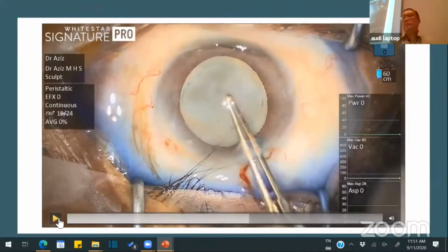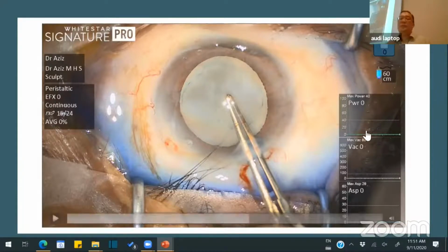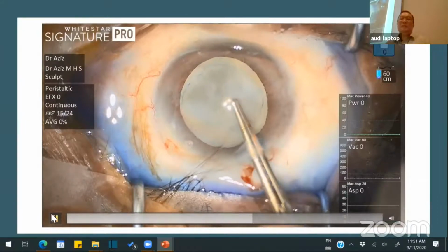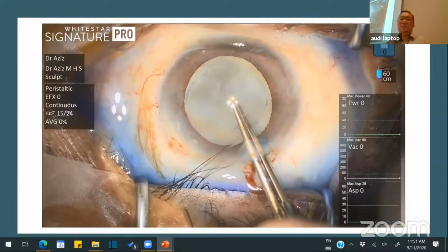So with this intumescent cataract, mostly people would just insert a needle in, aspirate. How much can you aspirate? We don't know. And whether the cortex is something you can actually aspirate or not, we don't know. And probably it's too intumescent. The act of putting the needle in will completely tear the capsule because it's so tense. So what do I do? Utrata, like usual.